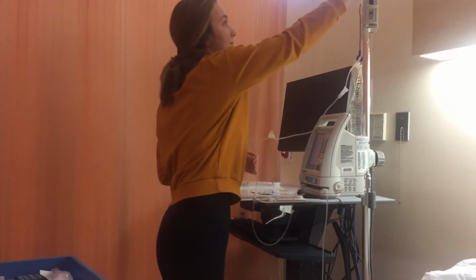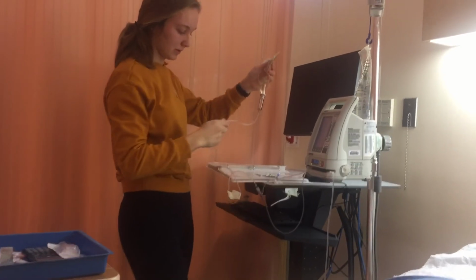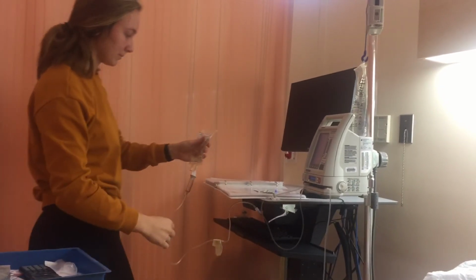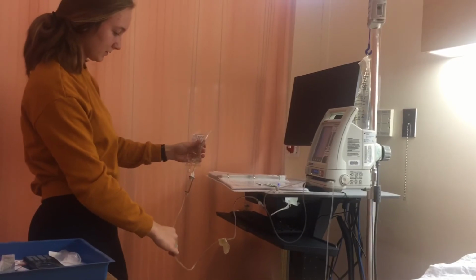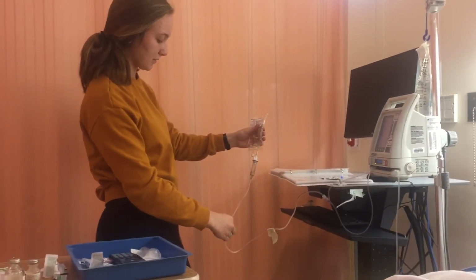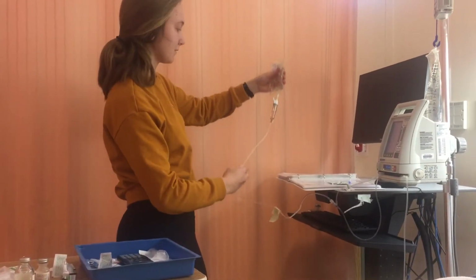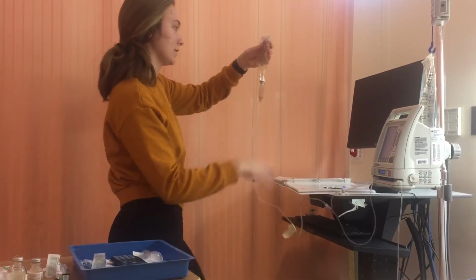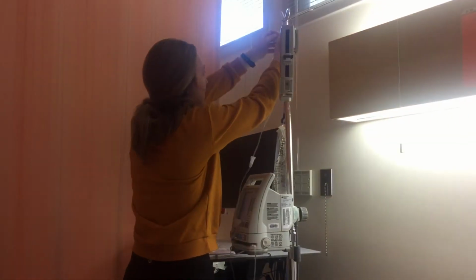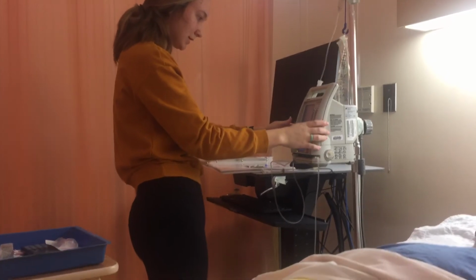So now I'm going to back prime. So I'm going to take this bag and I'm going to open up the clamp. So I'm going to lower it below the height of the primary infusion bag. And we're doing this to get all the air bubbles out of the tubing so that it doesn't cause a pulmonary embolism to the patient. So once the drip chamber is filled about halfway, we're going to hang the bag back up, close the roller clamp, and now I'm going to program my secondary line.